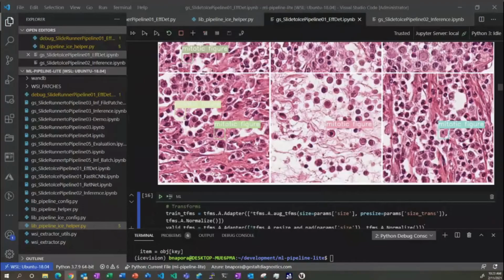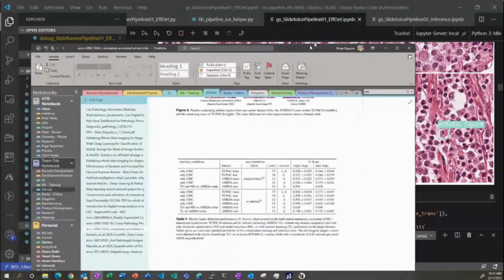Yeah, here. Let me bring up this paper here. But generally, if the color is not so important, one could experiment with grayscale or maybe contrast and lighting augmentations.